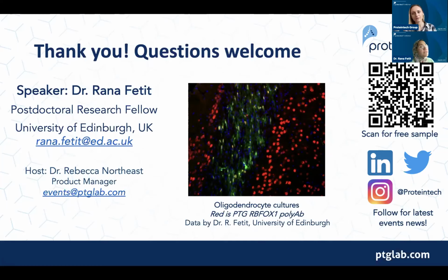Yes, you could actually freeze them at the sphere stage, at the OPC stage. Once they reach OPCs, you can freeze them. We personally like to passage through and do our set of analyses, because when they get too big and you start chopping them, it's advised that you chop them only 3 times and not more than that, and you chop them every 2 weeks. So you can keep them at the OPC stage for up to 4 or 6 weeks, and after that I would throw them away and start again. But yes, you can freeze them at the sphere stage when they are OPCs, and then start again. You basically just thaw them in the media that they were in before.